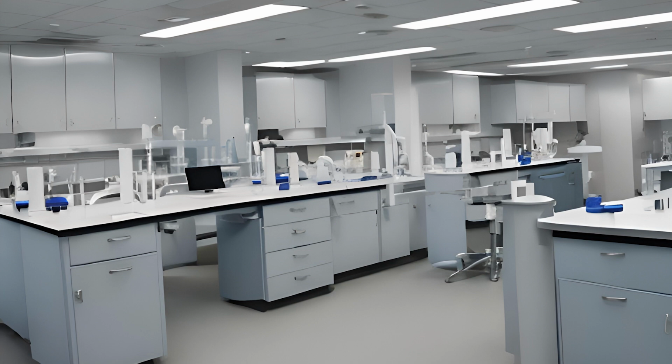You have to make sure that that card they show you, if your facility requires the physical showing of an ID card, matches the test requisition that you have. After you've identified your patient, you're going to verify any dietary restrictions and allergy sensitivities that they have.